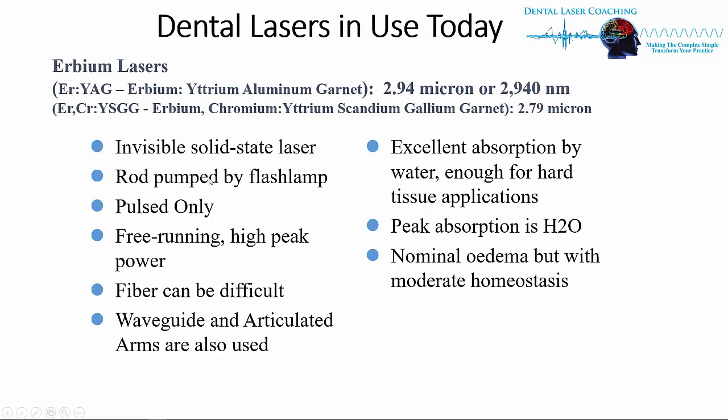Then we have erbium lasers. Again, it's a solid state, very complicated mechanism inside. It's pulsed only. It does not have a continuous wave option. It can be delivered by a fiber, but it can be difficult. There were some fiber problems with the first generation lasers because that's a lot of power going through a fiber.